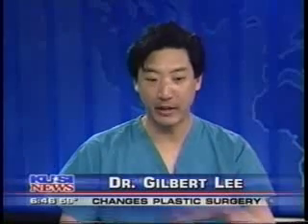So basically, instead of what we think of liposuction, which is, in very crude terms, sucking out the fat, this in effect kind of heats and breaks up the fibrous material or the fat cells? Right. It actually vibrates it so quickly that it causes the cells to break. That releases the fat, and then at the second stage, we can suction it out. Let's put it to the test.